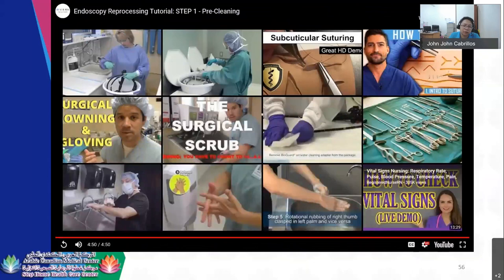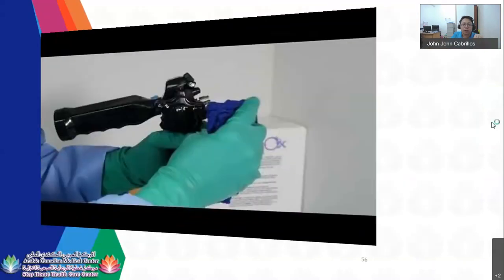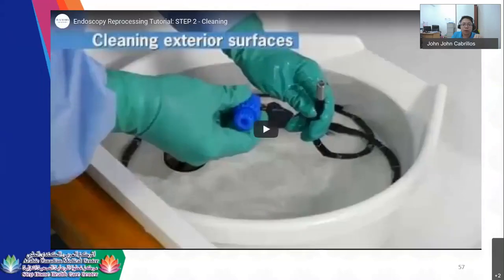So that's the proper way to pre-clean the endoscope prior to sending it to the decontamination area. Usually it should be done by any representative of the OR, or the user itself will do the pre-cleaning prior to sending it to the CSSD, or prior to collection of the instruments by the CSSD technician. The next step is the cleaning process, so just familiarize yourself with the cleaning process of your endoscope.